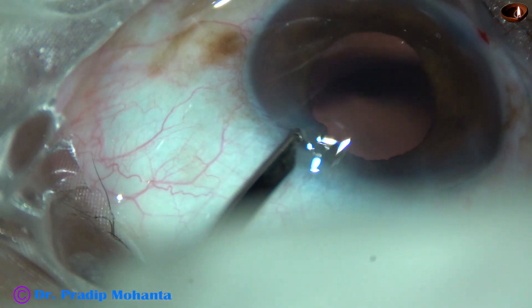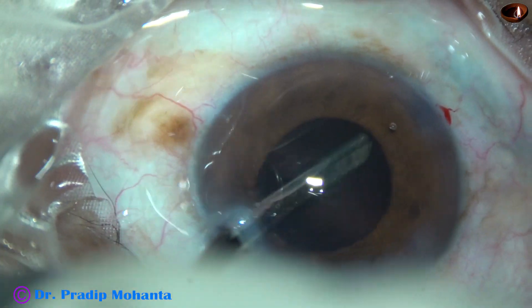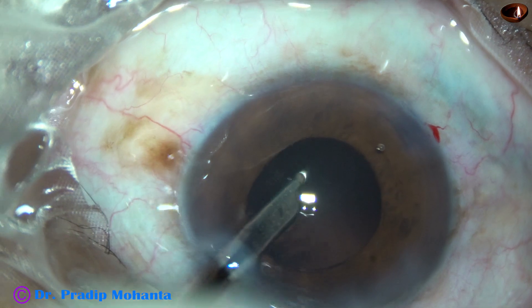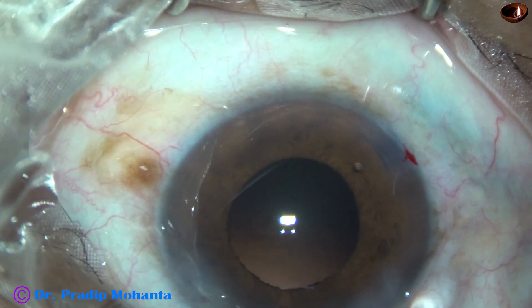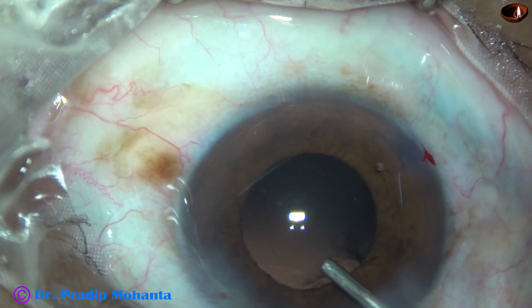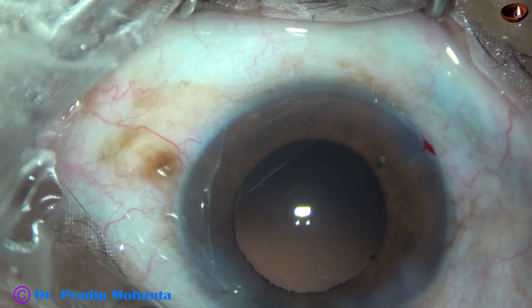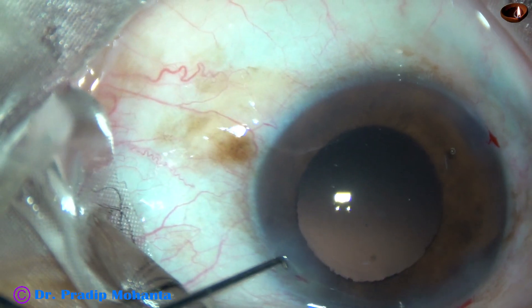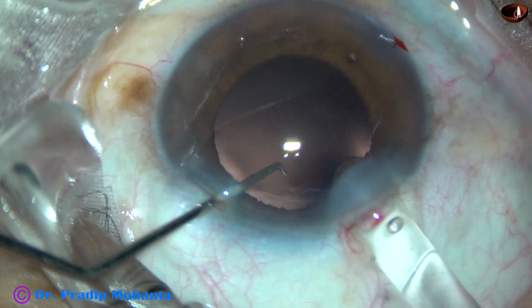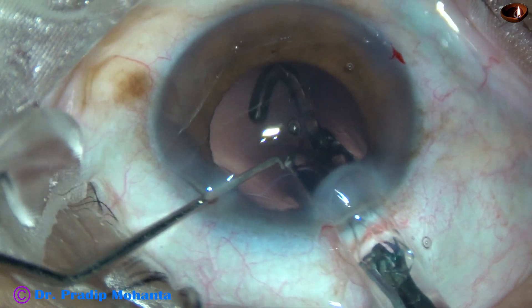Now go through the other side port and remove the cortex from the other side. Then visco is injected to fill up the capsular bag and the anterior chamber, and a single-piece monofocal intraocular lens is implanted in the capsular bag.